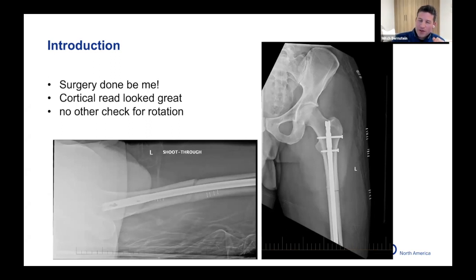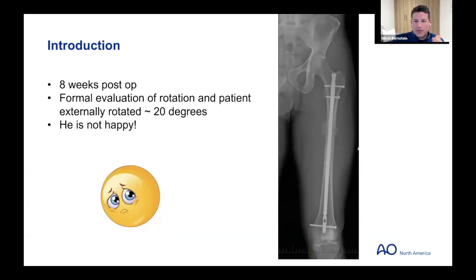I thought the cortical read was very good. He was weight bearing as tolerated. He was doing well, but no specific exam by me to assess and even ask him about what he thought about rotation. And imaging wise, no, there's no CT post-op.